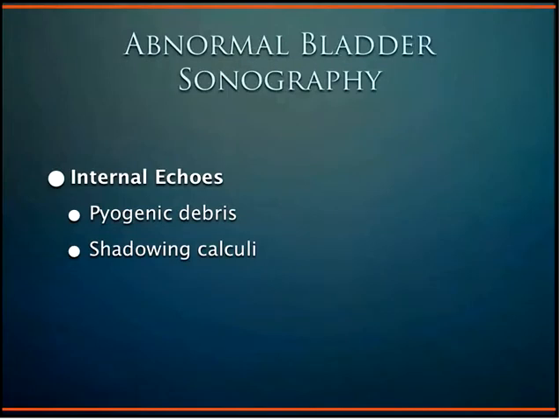Other findings to keep an eye out for are the presence of echogenic material. Bladders should be anechoic and completely devoid of internal echoes. The presence of debris swirling around in the bladder may represent evidence of bladder infection.